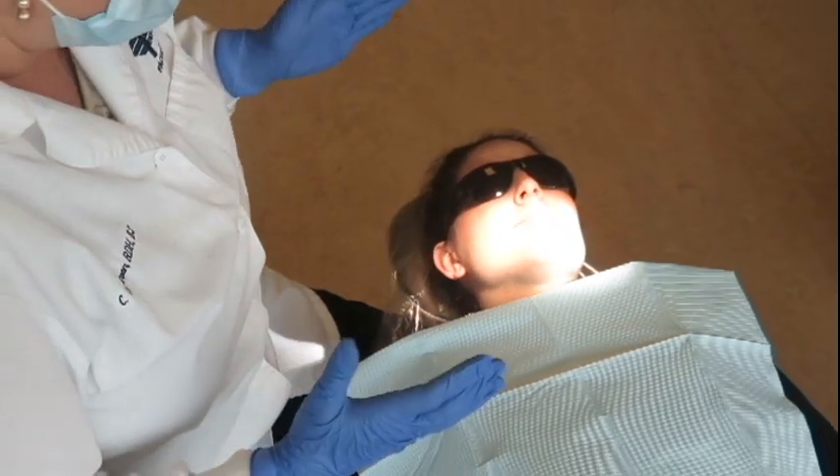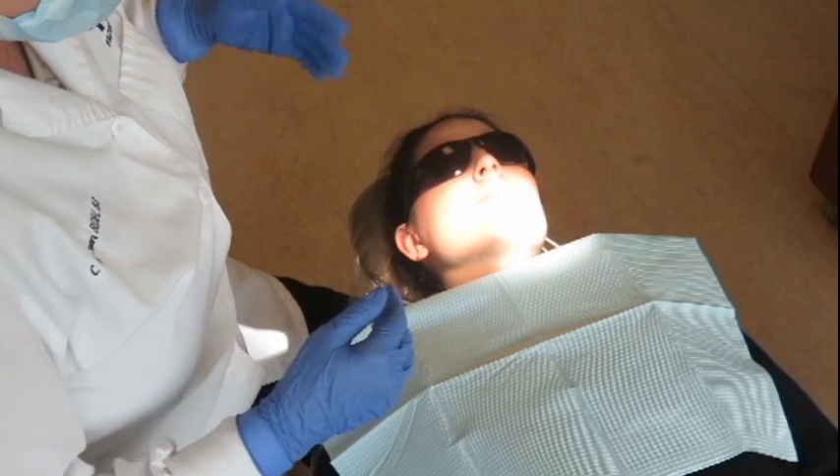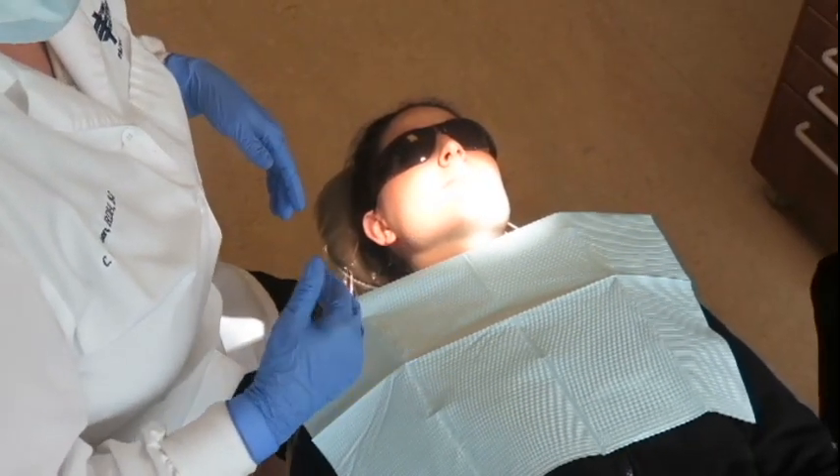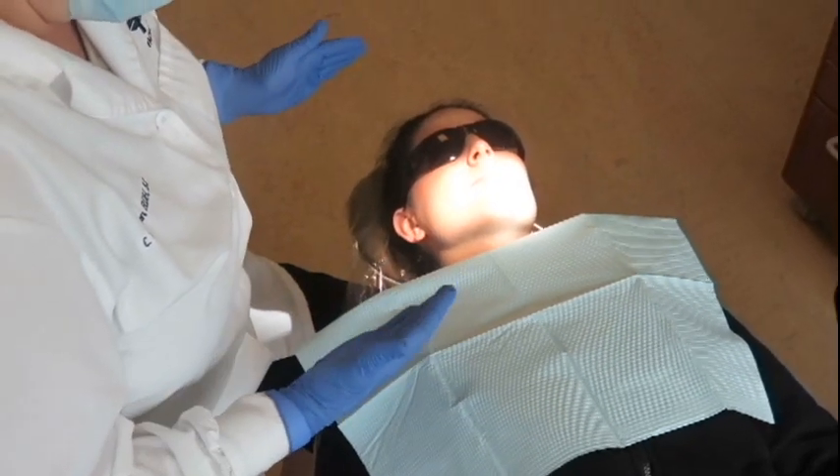I'm going to demonstrate the PSA injection today. Before you start the injection, it's really important to make sure that your patient is in the right position. It's more critical with a PSA than with any other injection that you have your patient at the right height for you.